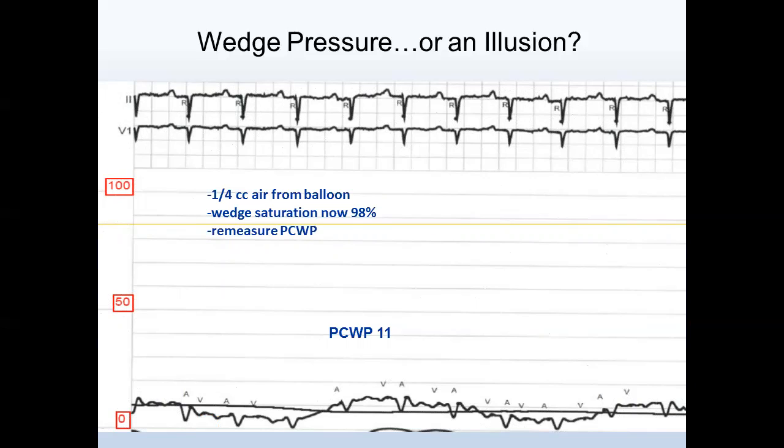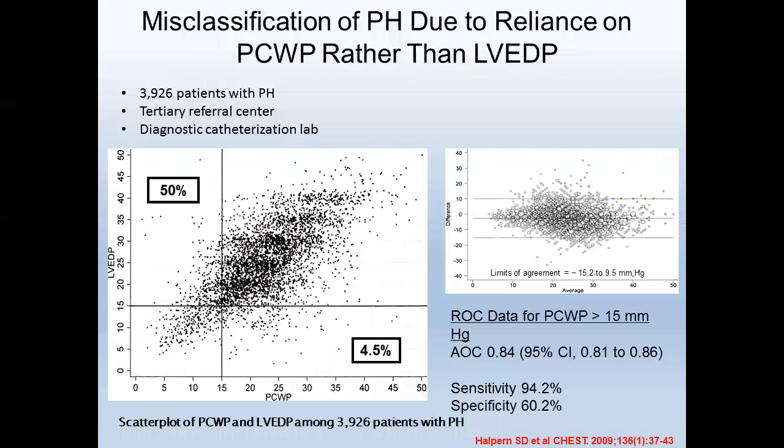Deflate the balloon, you're okay to dive deep in. When you're re-inflating, be careful and very, very slow. Okay, don't go fast. That's when you rupture your pulmonary capillaries, cause a stroke. People die. So hopefully it doesn't happen, but I'm just saying it can happen. You just have to be careful. Okay? You don't keep doing it.